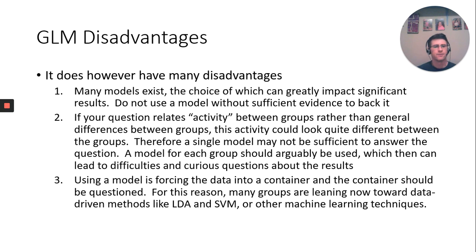And this has gotten a lot of groups more and more interested in what's called data-driven or data-centric rather than model-driven or model-centric, which is the GLM methods, and use different learning algorithms to dictate whether or not something is active or not active. And I have LDA and SVM. LDA stands for Linear Discriminant Analysis, and SVM is support vector machines. Both are very common in the field.